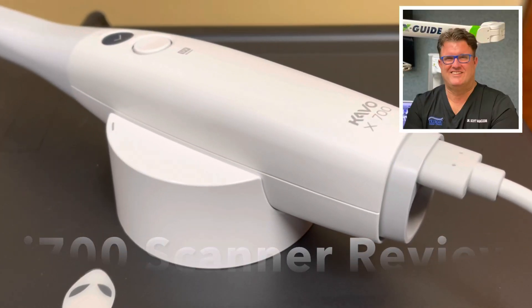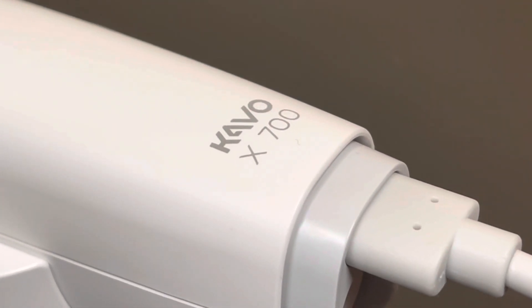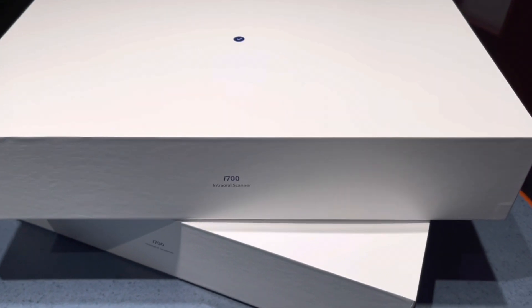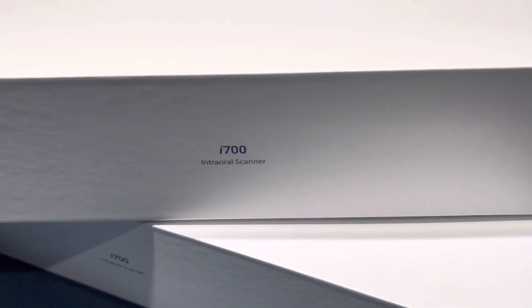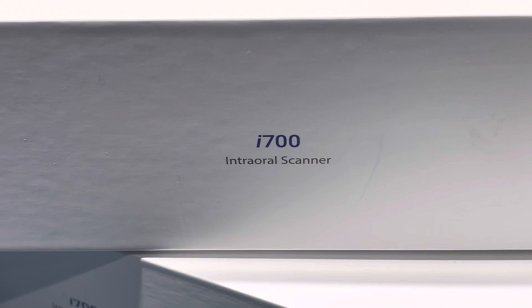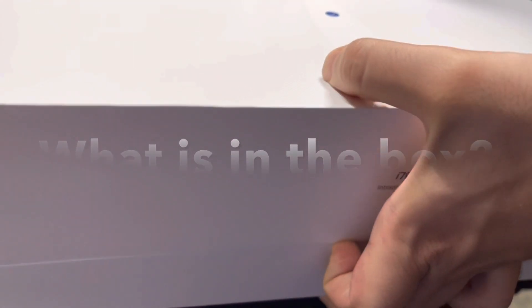Hello there, it's Dr. Scott McLean and I can't wait to share my experiences with the i700. This came today in the mail and you can see it came in two boxes. My whole scanner is in two boxes which is incredible. We have the i700 here and we're going to open the box and have a look inside. I'm kind of excited — it's not too often I get this excited at work anymore, but this is like Christmas for me.